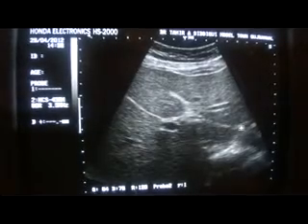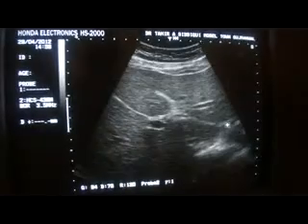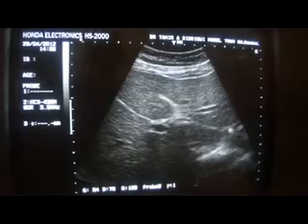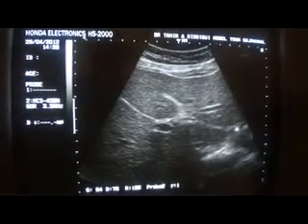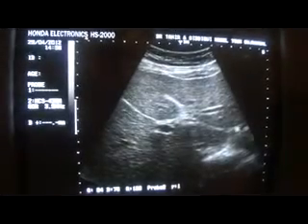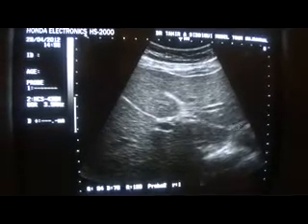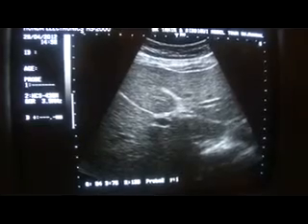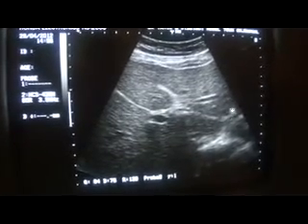You can see one straight linear structure, bright with no posterior shadowing; the second one, no posterior shadowing; and the third one. These three structures are: this is the median lobar fissure, this is the ligamentum teres in longitudinal section, and this is the ligamentum venosum.